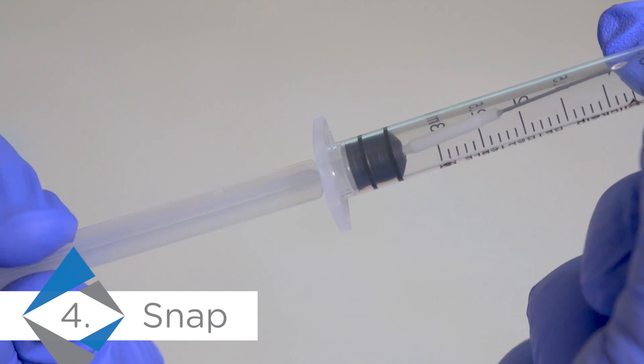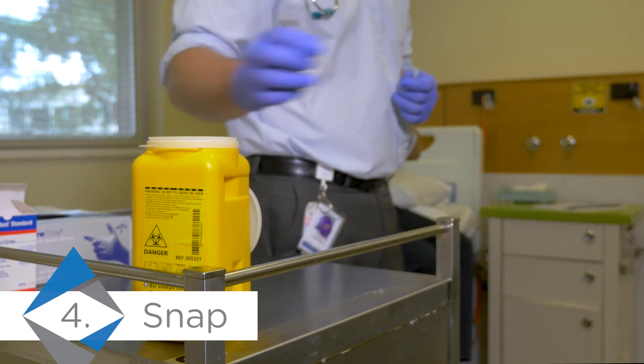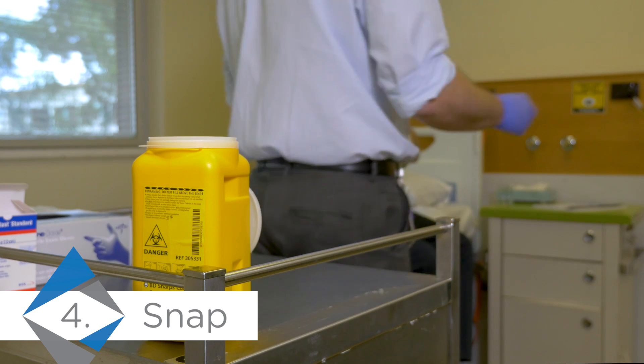Snap off the plunger at the breaking point to completely disable the syringe. The syringe can then be disposed of as per your organisation's protocols.